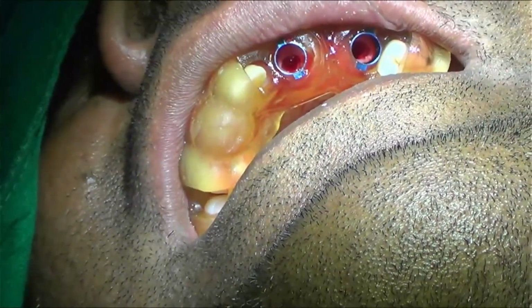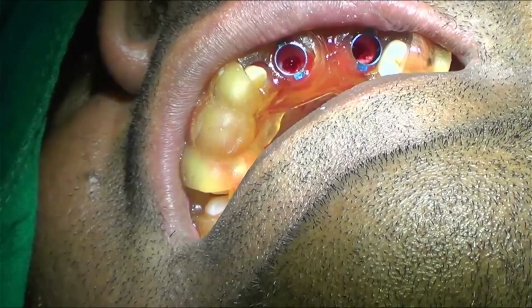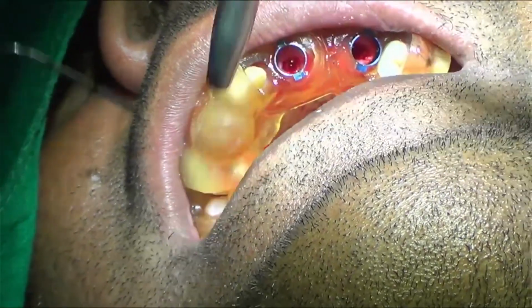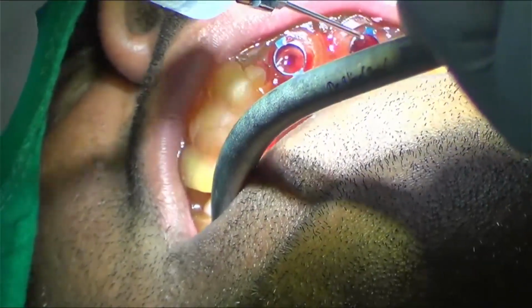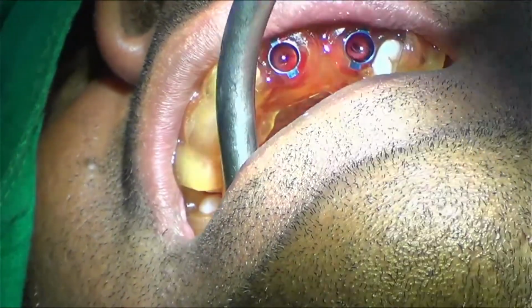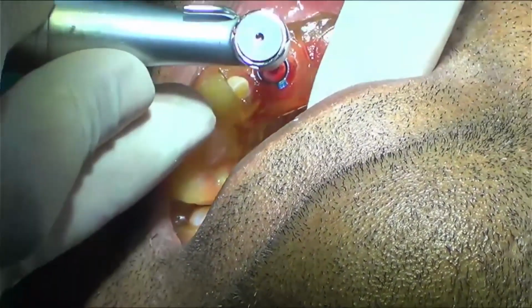So you see, I am not even keeping my drills in the osteotomy for even 2 to 3 seconds. It is actually not required. And when I am reducing my bone contact time, then definitely the bone heating is going to be very, very negligible. I want to do my profile drill once more because I feel the bone is a little bit harder.